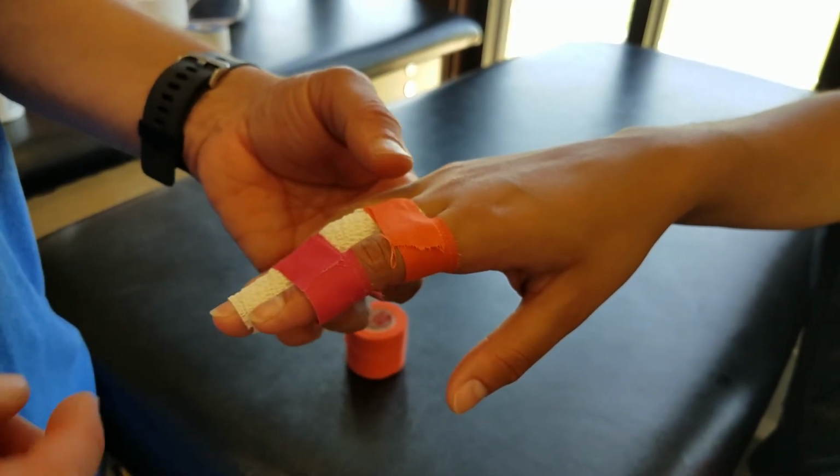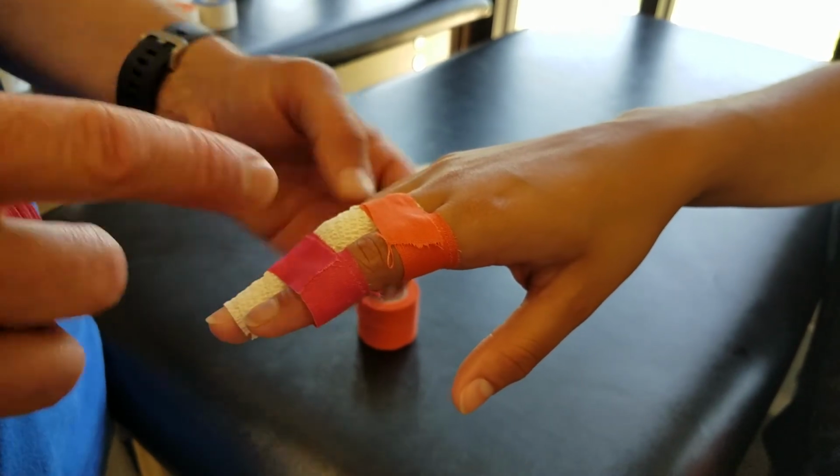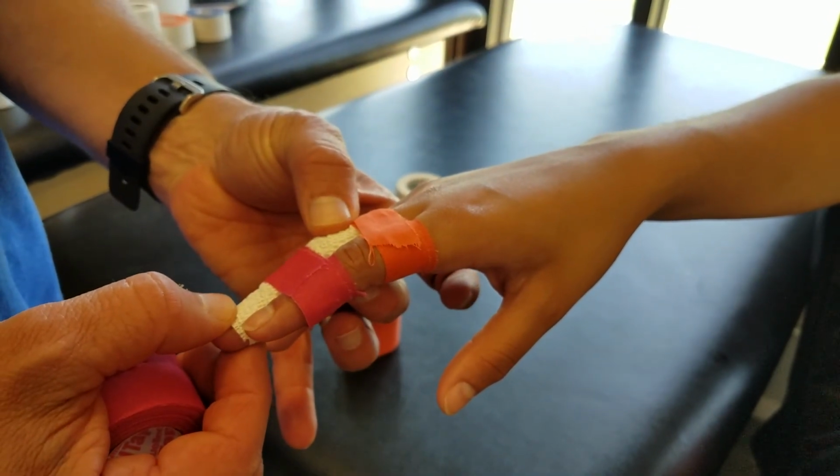So again, you've got some options, but like I said, I really like using that 1-inch Coflex for a compression wrap. So you've got the classic buddy tape job with a compression wrap. Okay, cool.